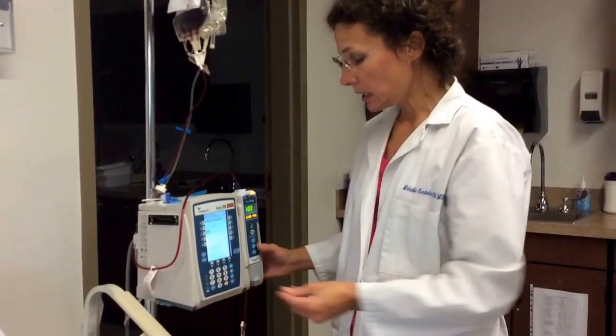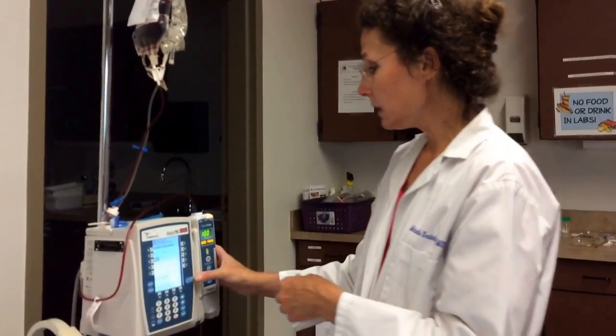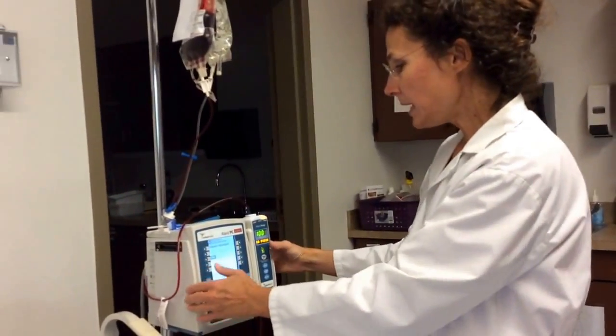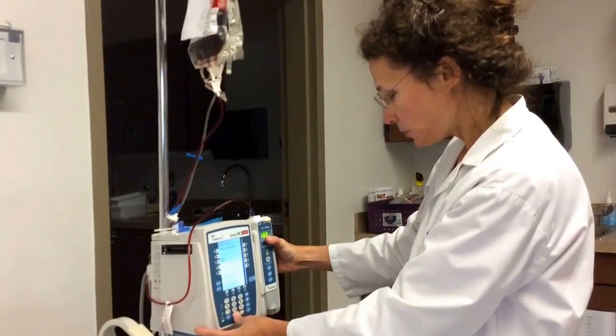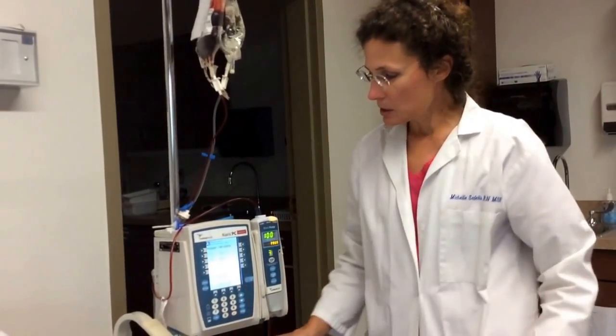So he had a unit size of 300, he's had 25 go in, so there's 275 remaining. I'm going to set it a little less than that, so that I have time to switch over to saline, okay? So 275 remaining, I'm going to set this for 240 volume to be infused. Okay, I've adjusted my rate.